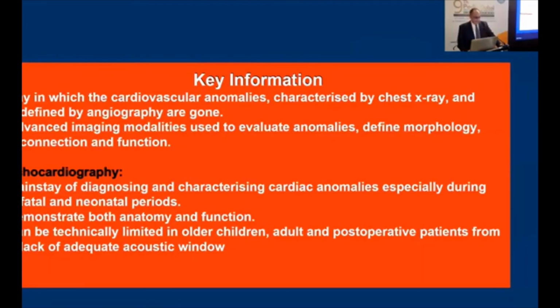Echography in the antenatal and neonatal stage is the mainstay of diagnosis, to characterize the cardiac anomalies and demonstrate anatomy and function, and could be technically limited in older children, adults, and post-operative patients because of the lack of adequate acoustic windows.